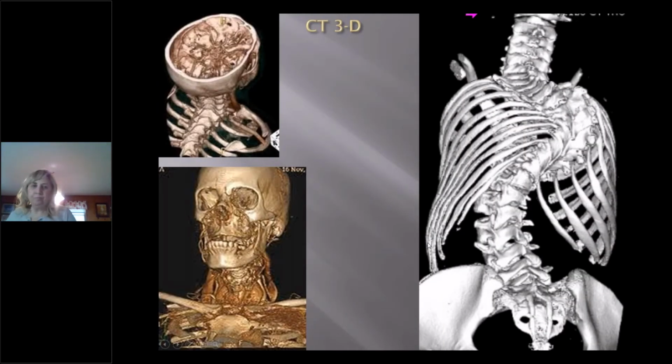CT, again, we see just phenomenal 3D reformats. And again, looking at the bony detail is just incredible. This is clearly a really ugly scoli. And a lot of times the universities will use this kind of stuff for big planning and to help you get a better idea of what's going on. So it can be beneficial for that, way outside the realms of what primary care is going to deal with. But just so you've got an idea of some of the applications there.